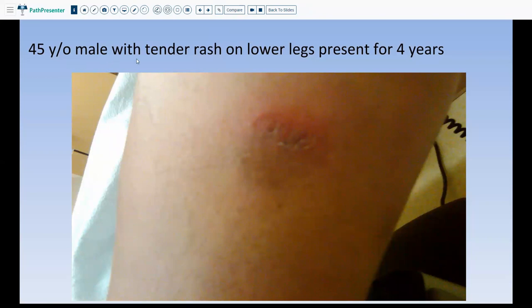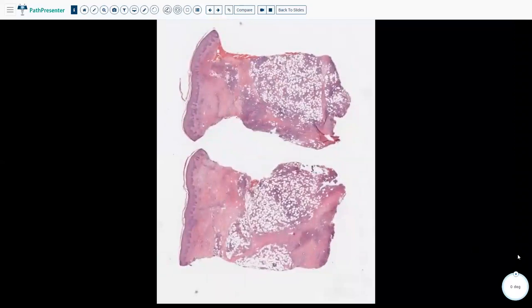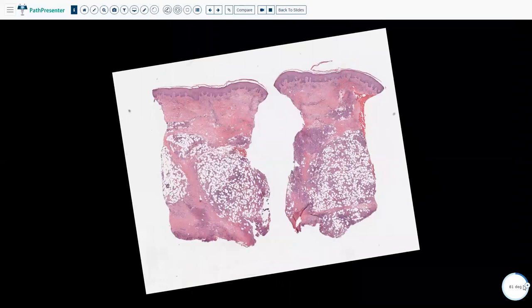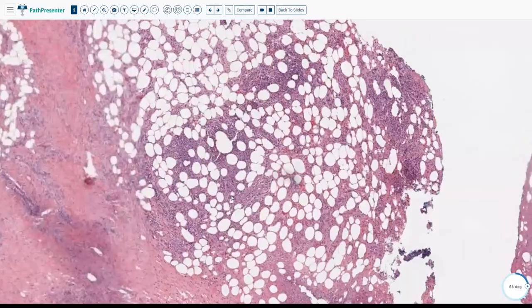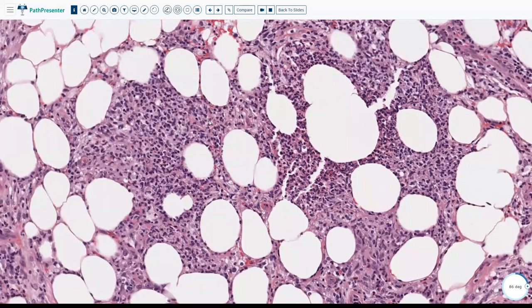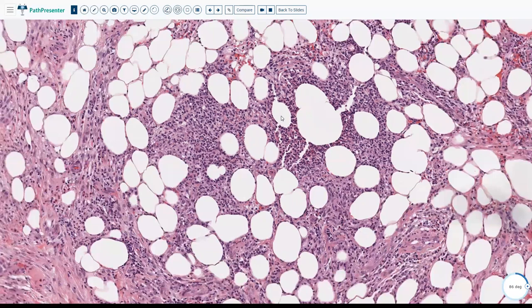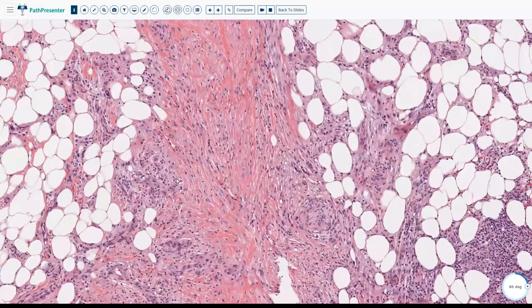The next case is a 45-year-old male presenting with tender rash on the lower legs, present for 4 years, located on the dorsal calf — unlike erythema nodosum which is at the front of the legs. On biopsy, the main action is in the subcutaneous fat. At high power, there are a lot of neutrophils forming almost abscess-like collections, along with a lot of fibrosis in the septa, and giant cells and macrophages — making this a suppurative and granulomatous inflammation.